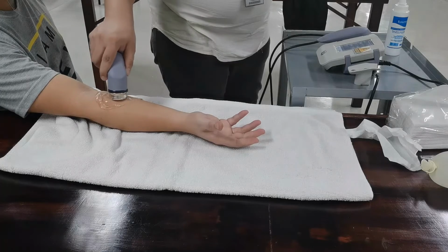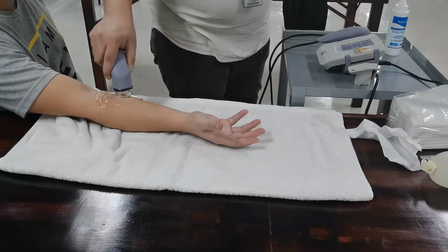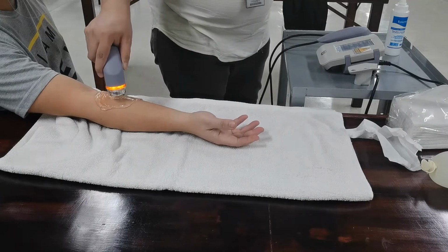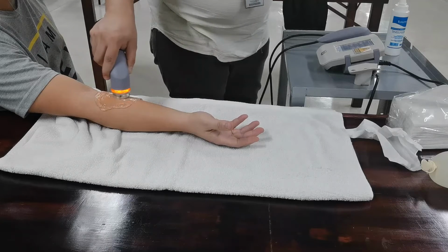Make sure that your rotations or cycles are 2 to 3 cycles per second and in constant contact with the patient's skin. If the ultrasound head is no longer in contact with the patient's skin while the treatment is ongoing, the ultrasound head suddenly lights up. The duration automatically pauses and the treatment also pauses. It will continue only once the ultrasound head is in contact with the patient's skin again.